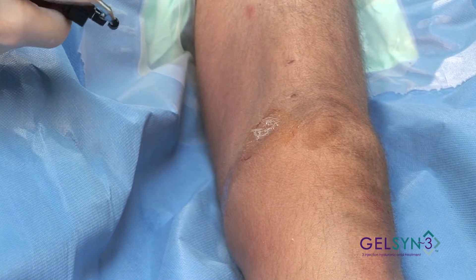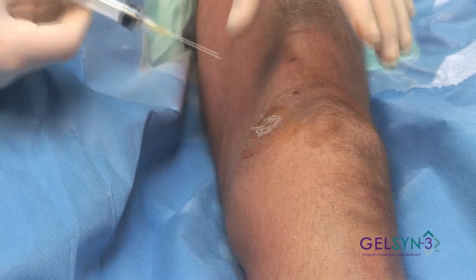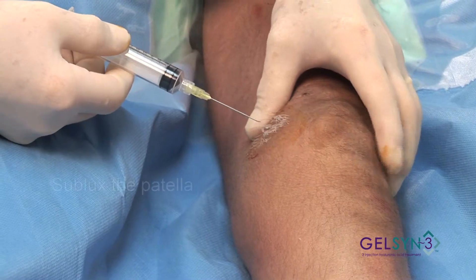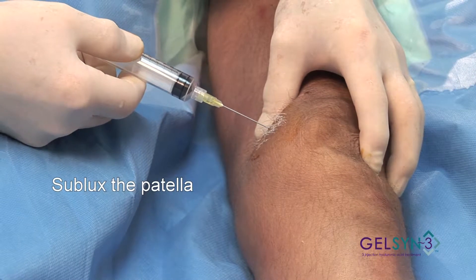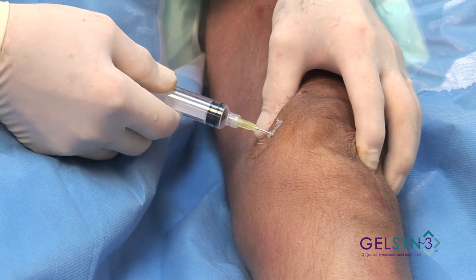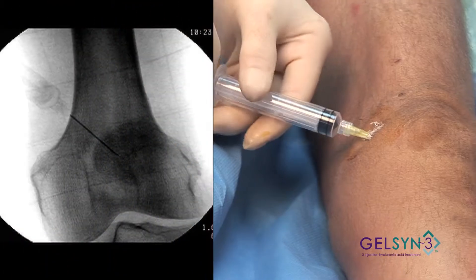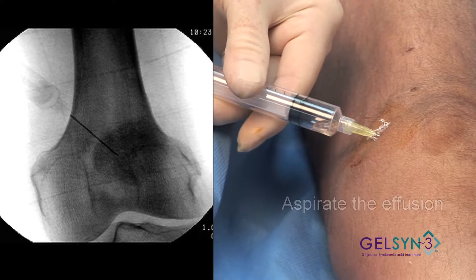You can also use a small amount of local anesthetic injected as well. Again, subluxing the patella, coming in from the 10 o'clock position, right to the undersurface of the patella.